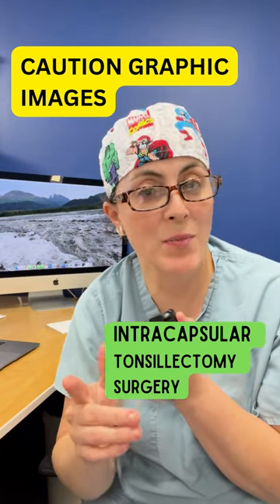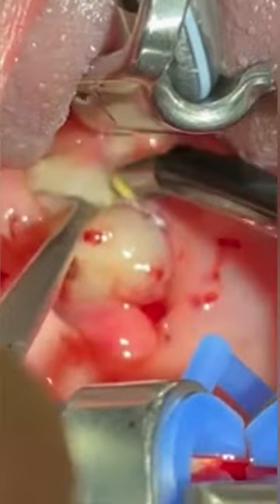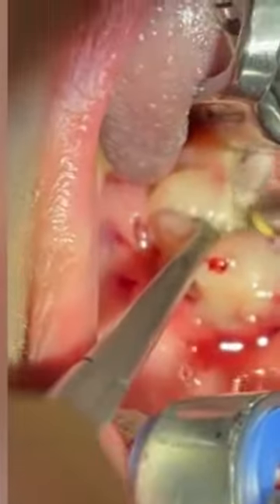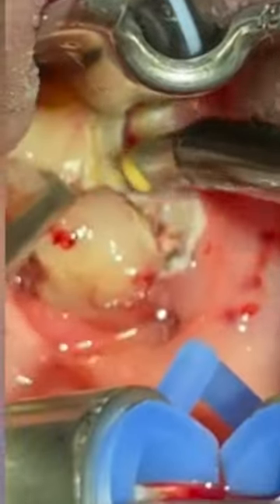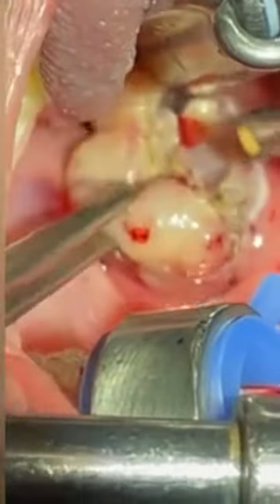Okay, now let's check out an intracapsular tonsillectomy surgery. With an intracapsular tonsillectomy, the goal is not to remove the entire tonsil tissue. For those reasons, we use a coblator — that's what this pen-like thing is here. It administers radiofrequency and saline mixed together, as opposed to cautery or heat, to remove the tonsil.